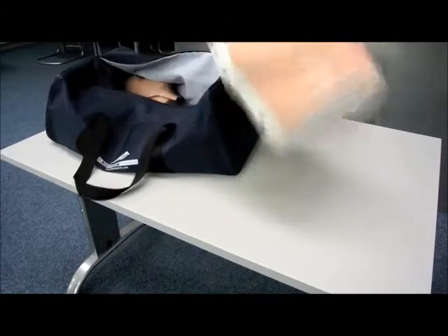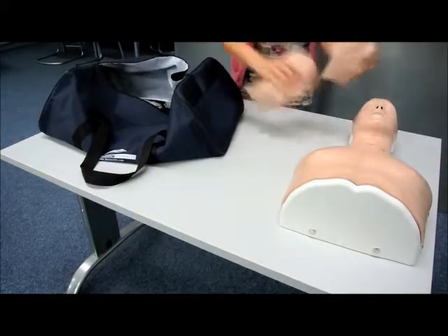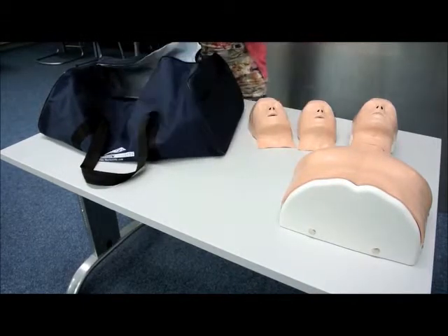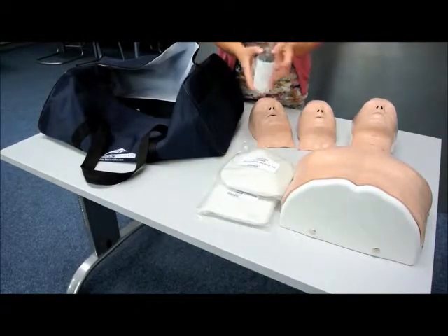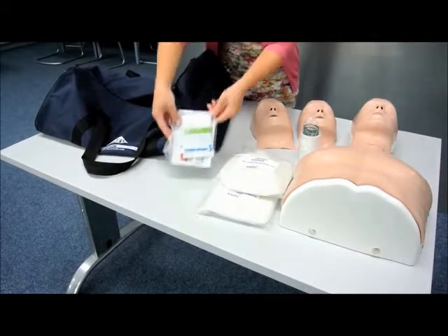Welcome to the Basic Billy product demonstration video. Basic Billy is supplied with two additional face masks, replacement adult and child lung bags, additional compression spring, and cleaning solution.